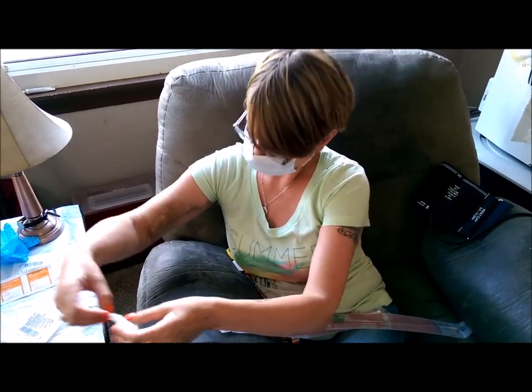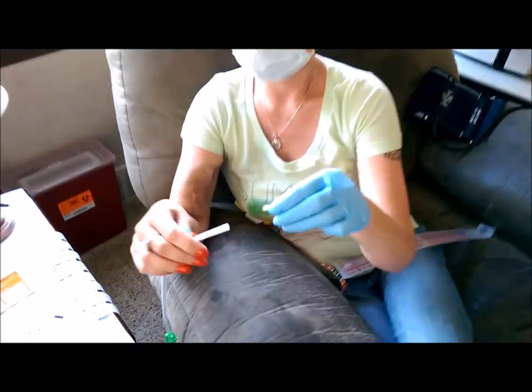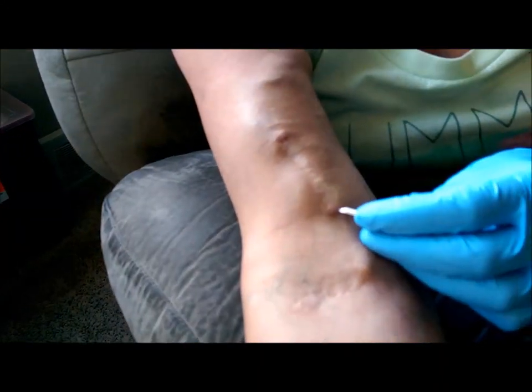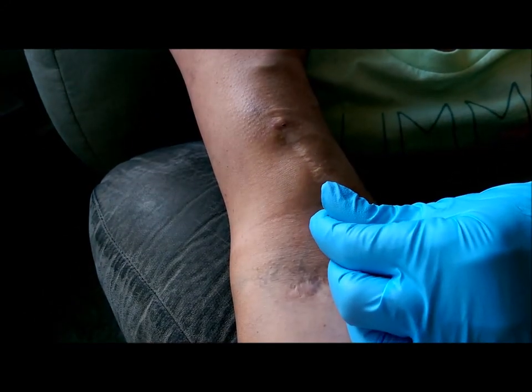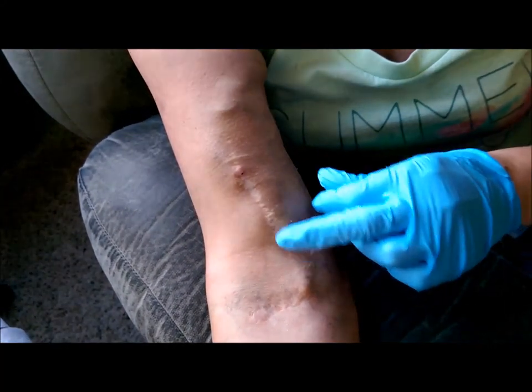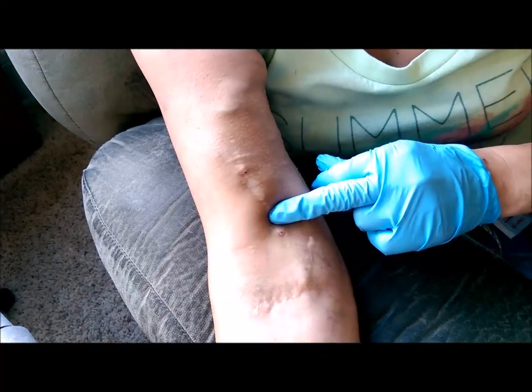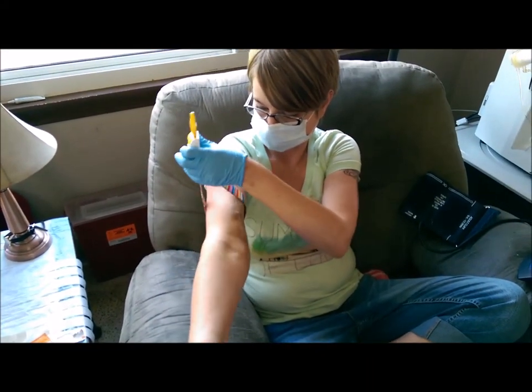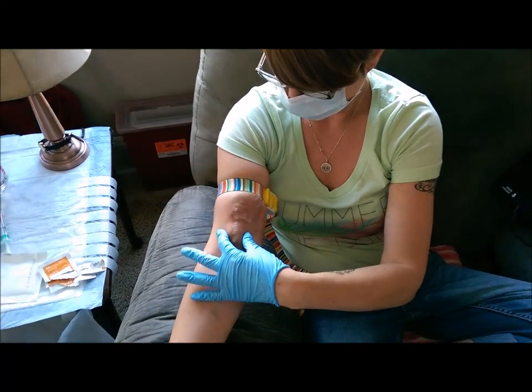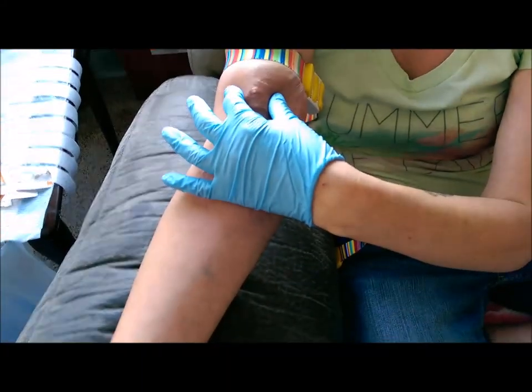Now I open my needles — each one has the delightful little scab picker. I start on my arterial needle. I have a hard time because this one is building a bump right there. We're almost ready to put the needles in. Tammy's going to put a tourniquet on her arm to make her fistula nice and plump and juicy. You can see this is the actual vein right here — that's how big it is. Since she can't easily do it herself, I'm going to give the camera to her.